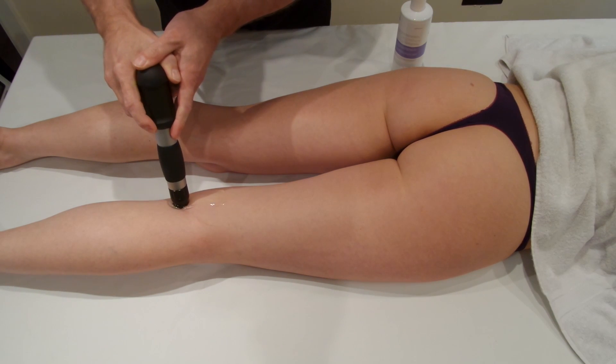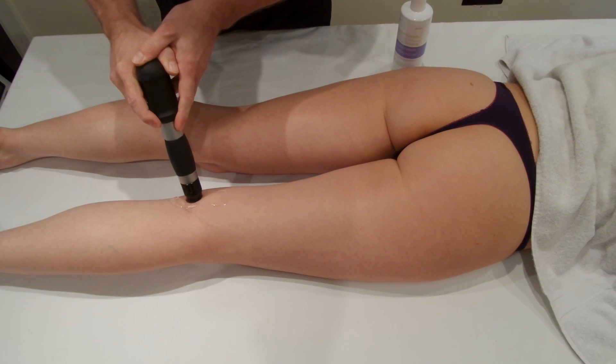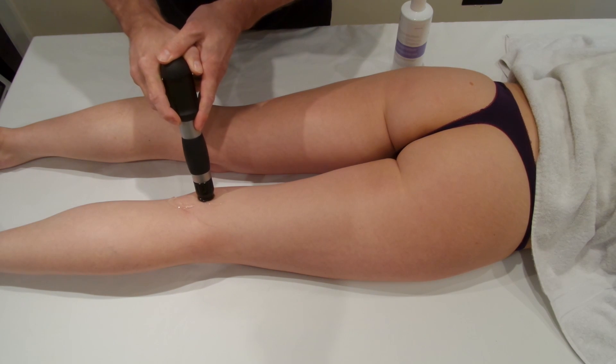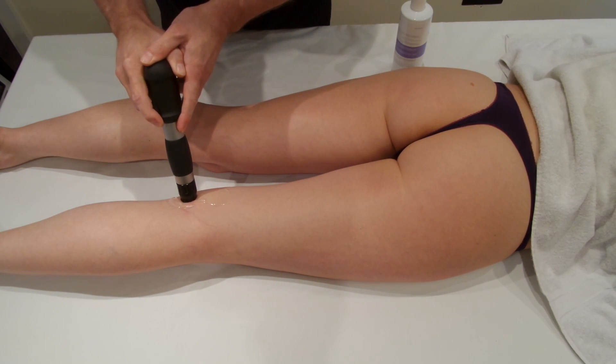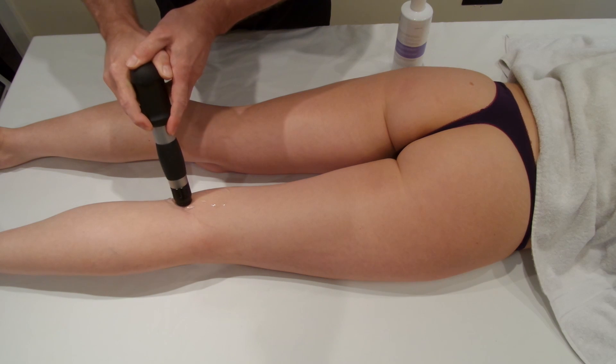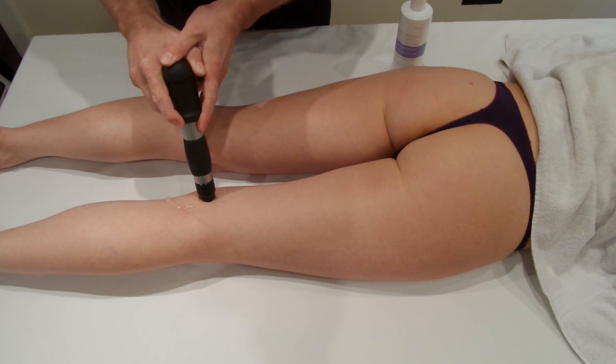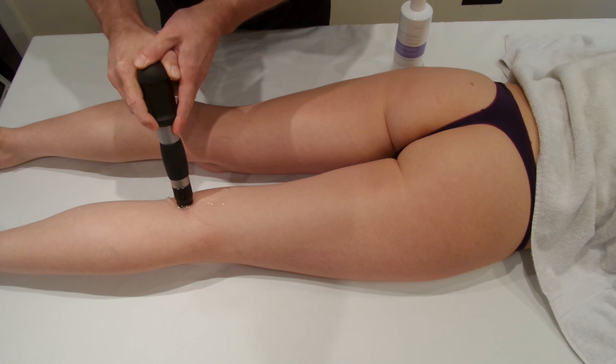We will be moving across the tendons in this treatment, which is why we're using 2000 shocks, not a lower number like 1000 shocks. We're just moving backwards and forwards across the tendons, looking for areas of particular pain and areas that are particularly thickened.